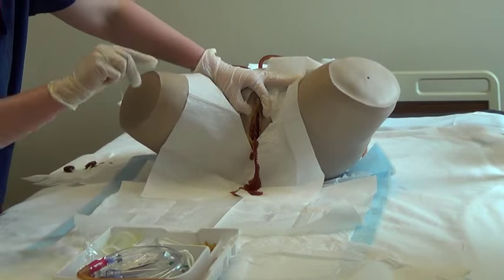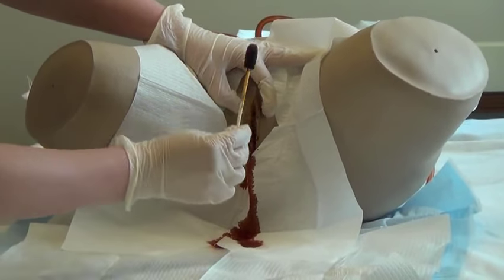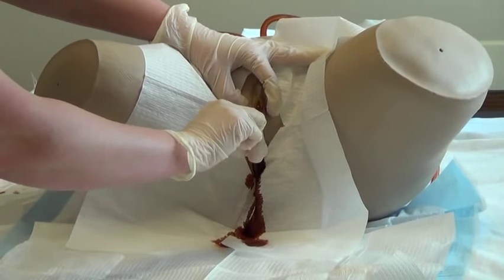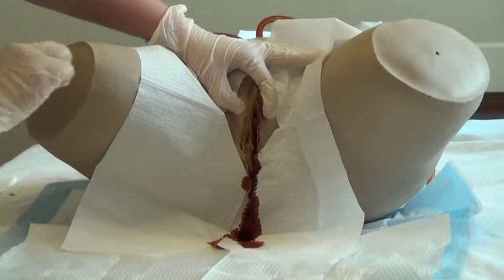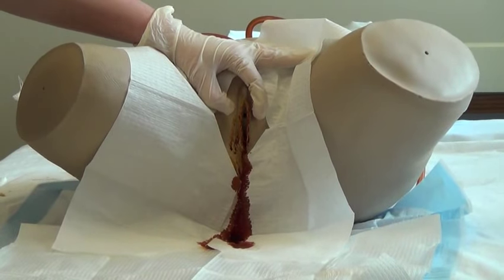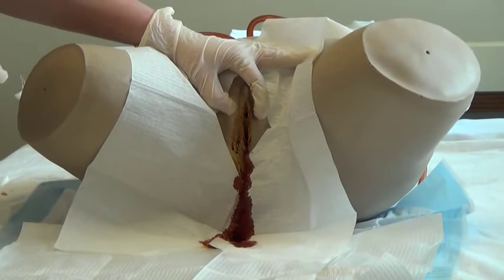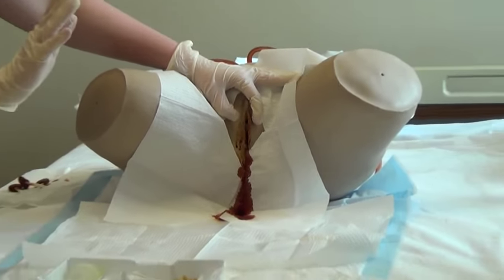The third swab stick is used for the area in the middle. Again, you should use the acronym ATM to remember the correct order. Be sure not to contaminate your sterile field with the now dirty swab sticks. They should be placed off to the side of your sterile field on your insertion side.